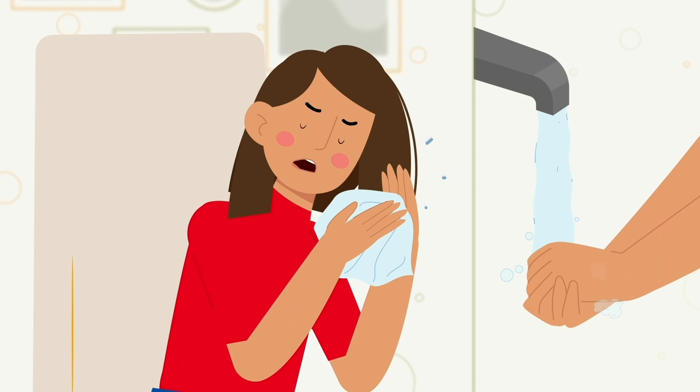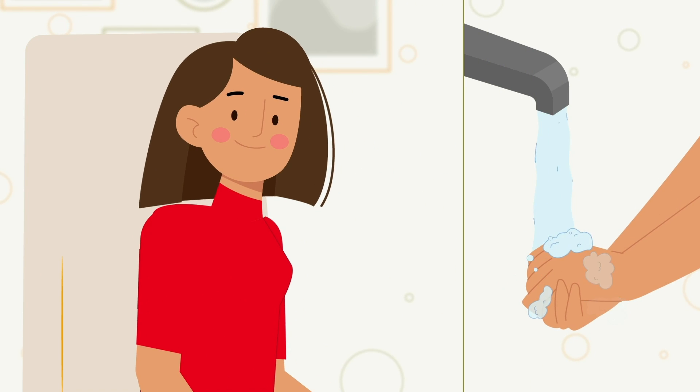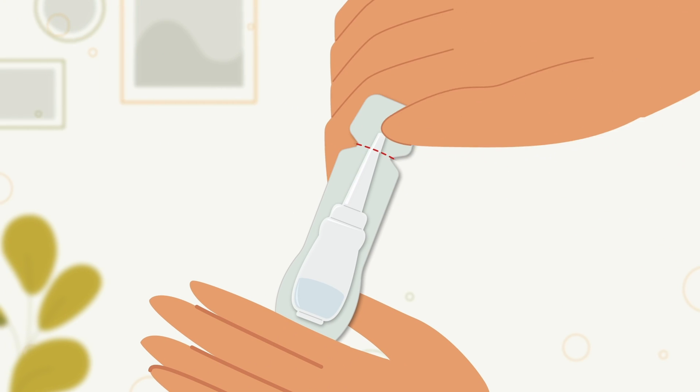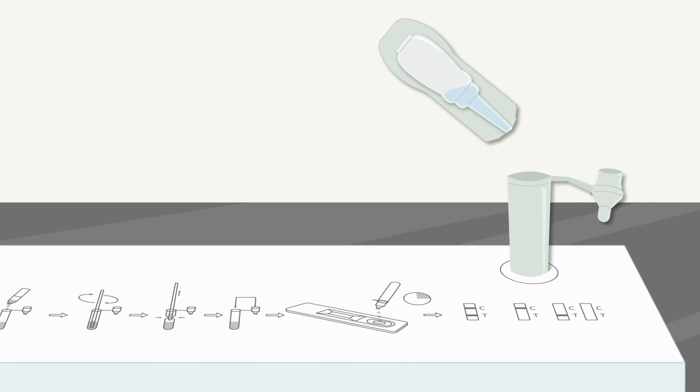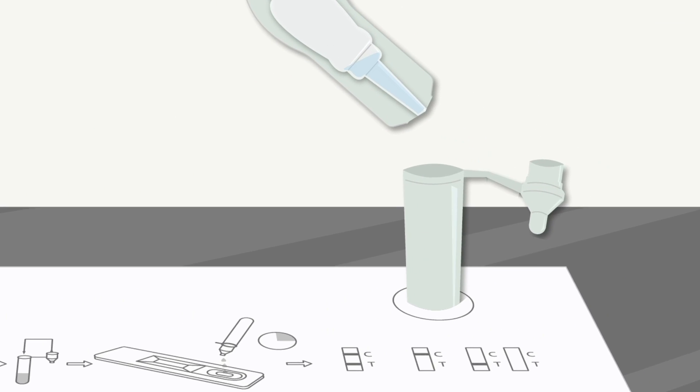Now, blow your nose and wash your hands. You are ready. Open the buffer bottle and squeeze all the liquid out and pour it into the extraction tube. Be careful that the bottle doesn't touch the tube.